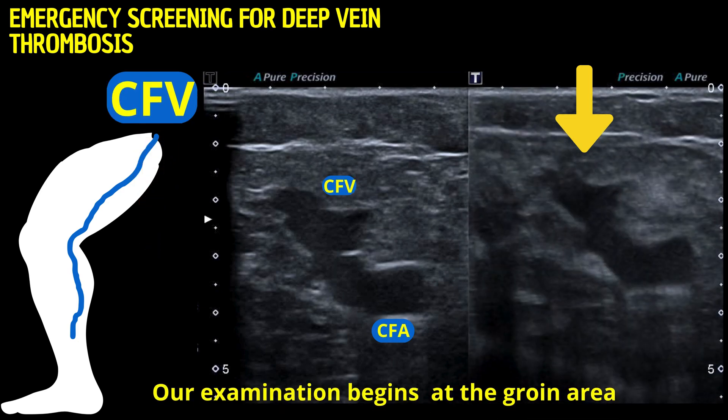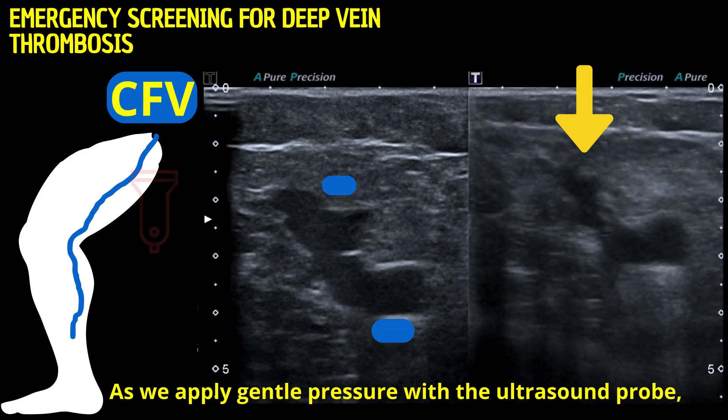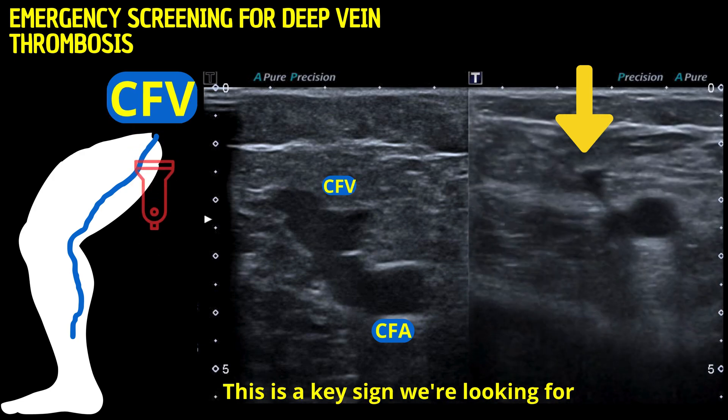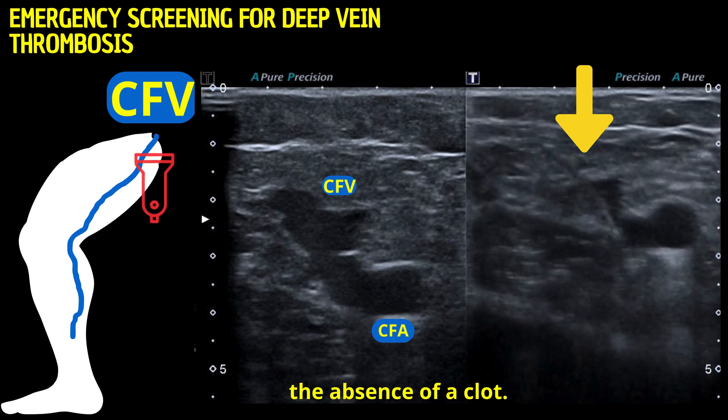Our examination begins at the groin area, where we'll locate the common femoral vein. As we apply gentle pressure with the ultrasound probe, we observe the vein's compressibility. This is a key sign we're looking for. A compressible vein typically indicates the absence of a clot.